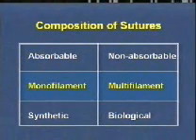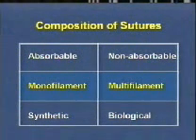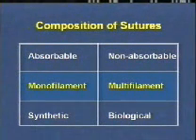Multifilament sutures consist of several filaments or strands, twisted or braided together. This affords greater tensile strength, pliability and flexibility. Multifilament sutures may also be coated to help them pass relatively smoothly through tissue, enhance handling characteristics, and minimize the risks associated with bacterial growth within the strand. Coated multifilament sutures are well suited to intestinal procedures.